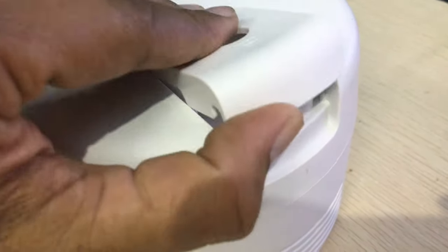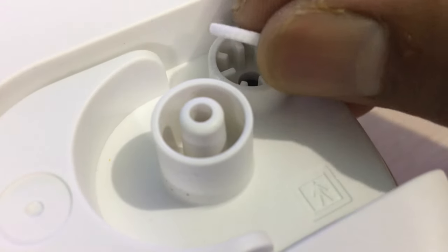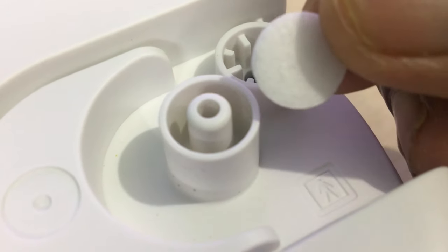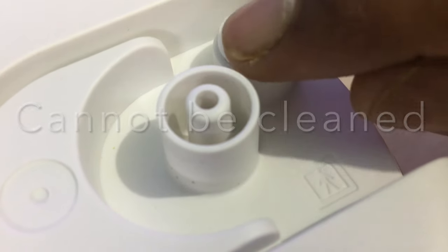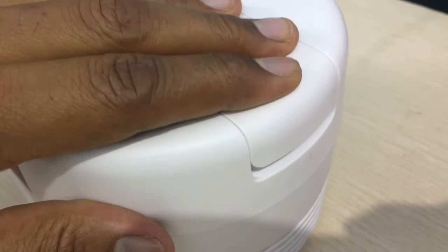To check the filter, remove the cover by pulling it up. Remove the filter and check if it's free of dust and not wet. Remember, the filter cannot be cleaned and is good to replace if used for more than 60 days.